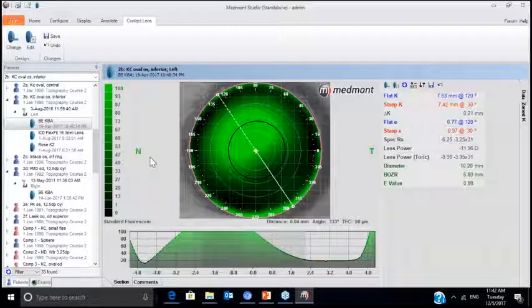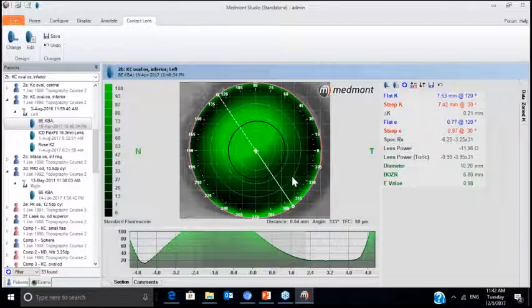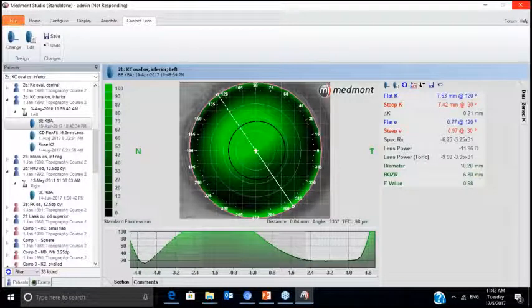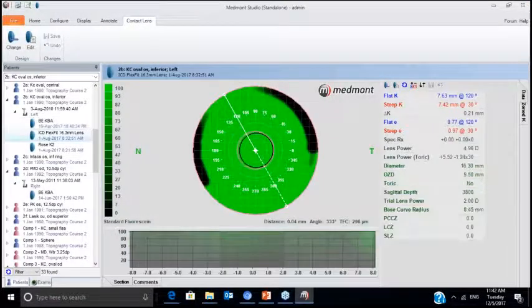And in this case, we can see if we go with a very steep base curve around 680, we can clear over top of the thin portion, the keratoconic area. We could fill in this space in here, this gap where we have the bubble, with a high plus soft lens.